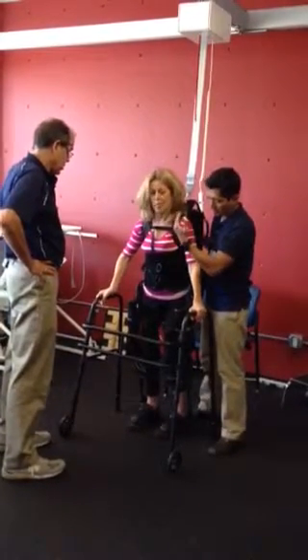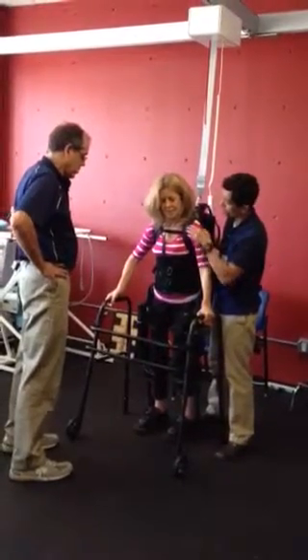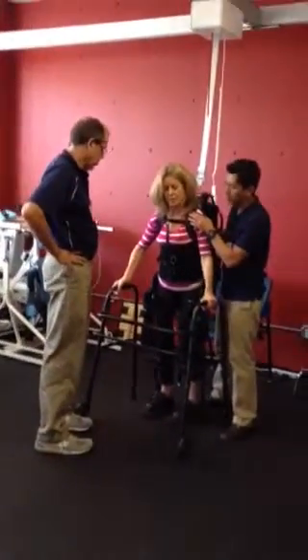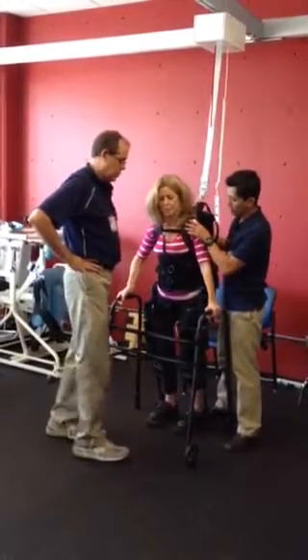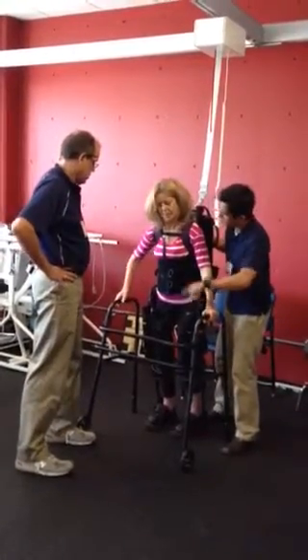So now we're going to do a little bit to the left, but also kind of the same — left and forward. So side first and then forward. When you get good at this it's going to sweep. But for now, go right side and go forward — because that will give you the clearance to move so that the left leg will step.